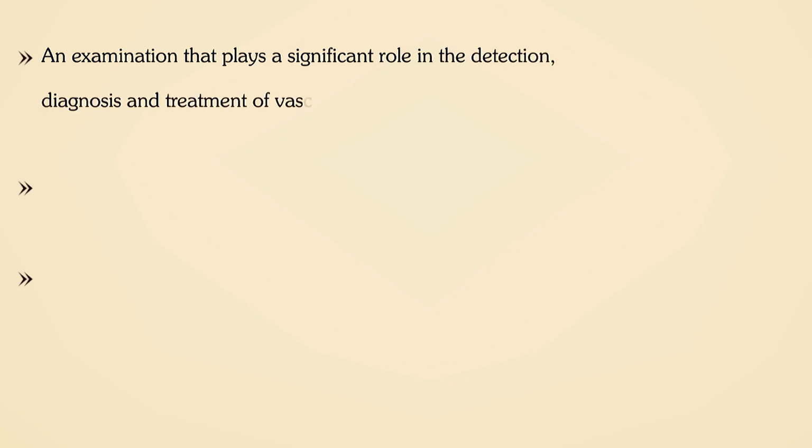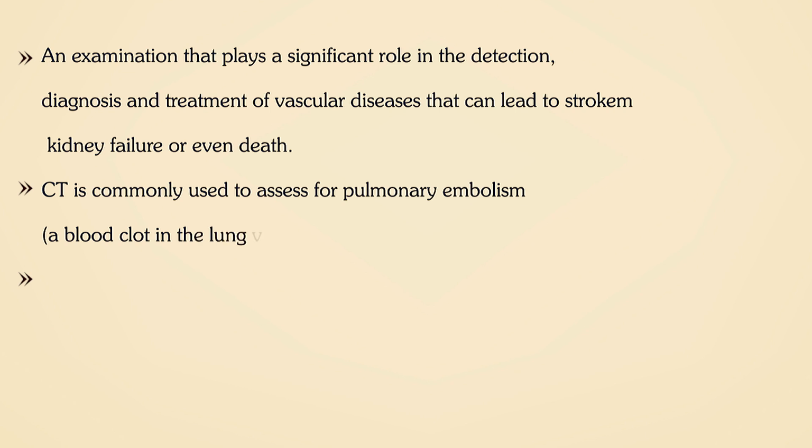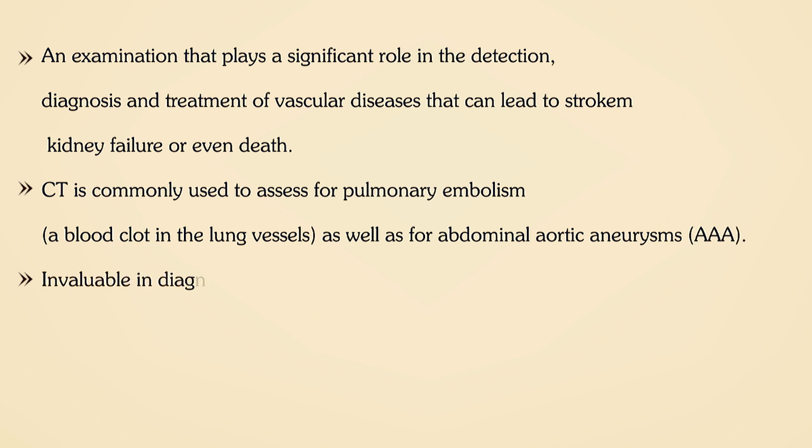It is an examination that plays a significant role in the detection, diagnosis and treatment of vascular diseases that can lead to stroke or kidney failure or even death. CT is commonly used to assess for pulmonary embolism, that is a blood clot in the lung vessels, as well as for abdominal aortic aneurysm.